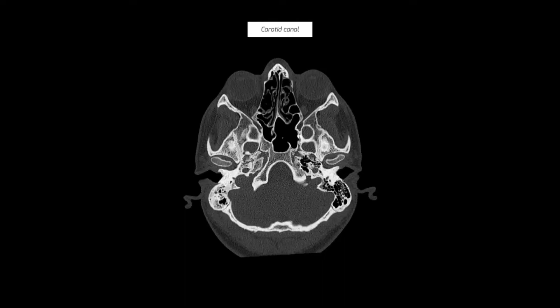If we go up one slice, we'll now start to see different structures. Let's have a look at the carotid canal. This is the right temporomandibular joint, and directly next to it you can see a foramen within the skull base — this is the right carotid canal. Here's the left temporomandibular joint and adjacent to it the left carotid canal.